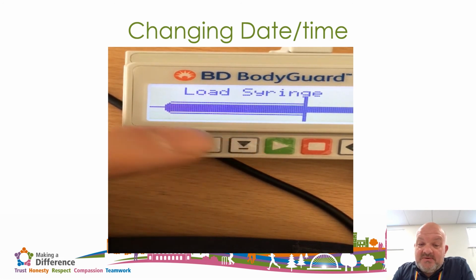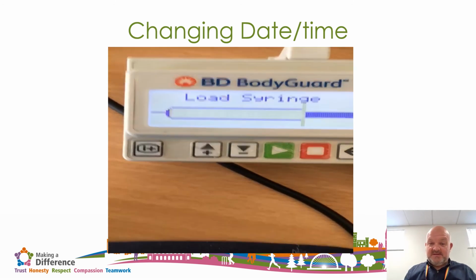And then when it's all done, you press exit, you press the green button and it's back to the load syringe screen, sorry.